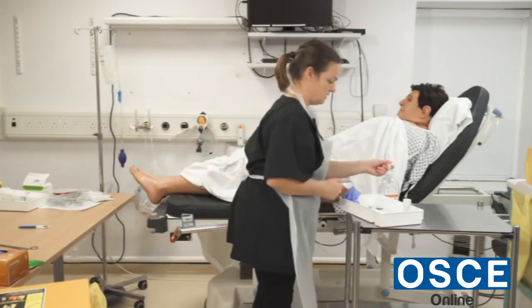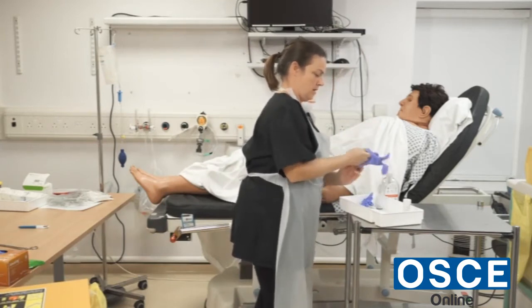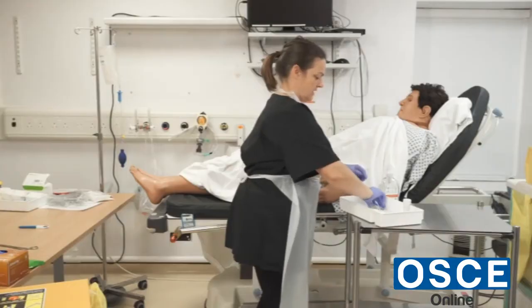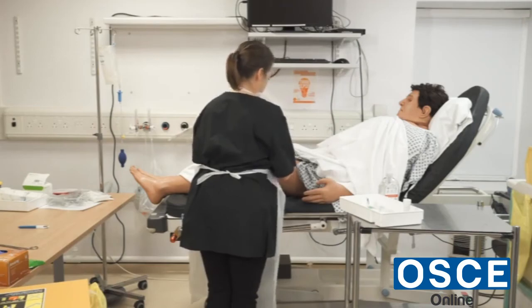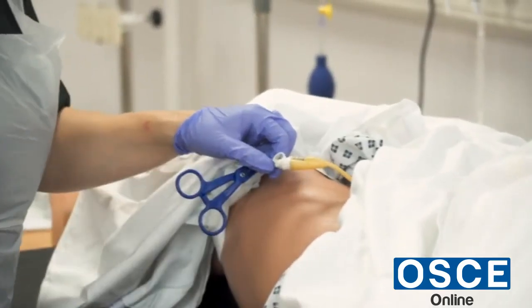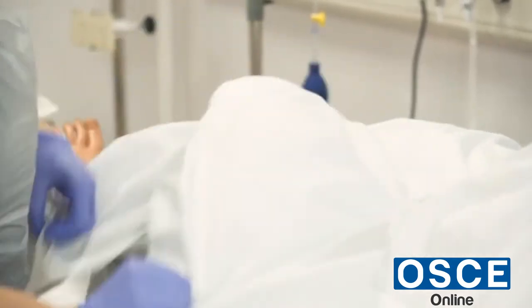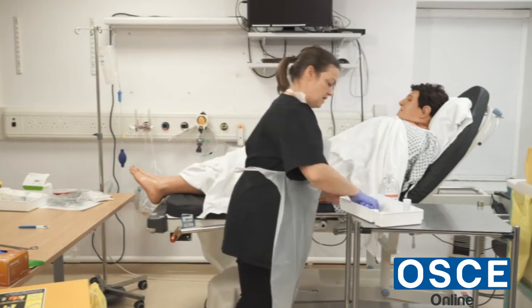I would now take these gloves off, put them in the clinical waste, gel my hands again, apply new gloves, take the last wipe, and clean the port again for 30 seconds, allowing 30 seconds to dry. Then unclamp the catheter — that's very important. I'm just going to recover the patient.